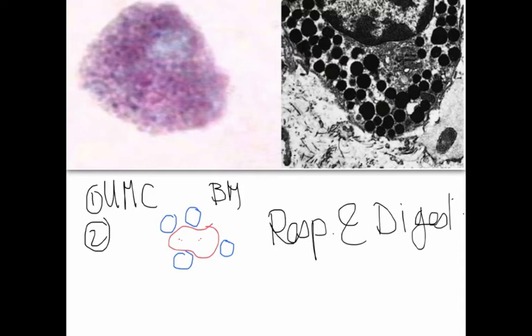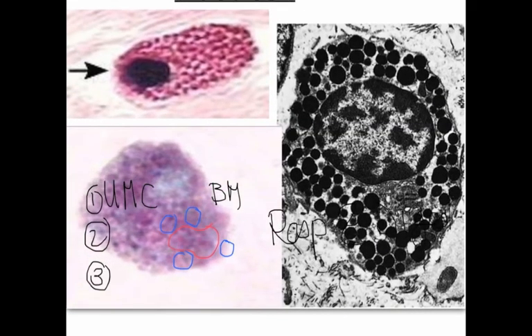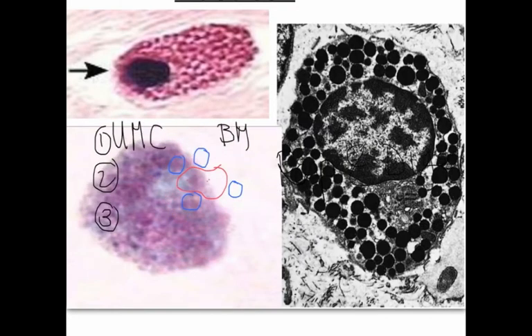Number 3 is the LM. As you see here, in the LM picture, it is an oval cell, the nucleus is rounded, and the cytoplasm is granular, and these granules can be stained. These are basophilic with hematoxylin, but they can also be stained by toluidine blue.